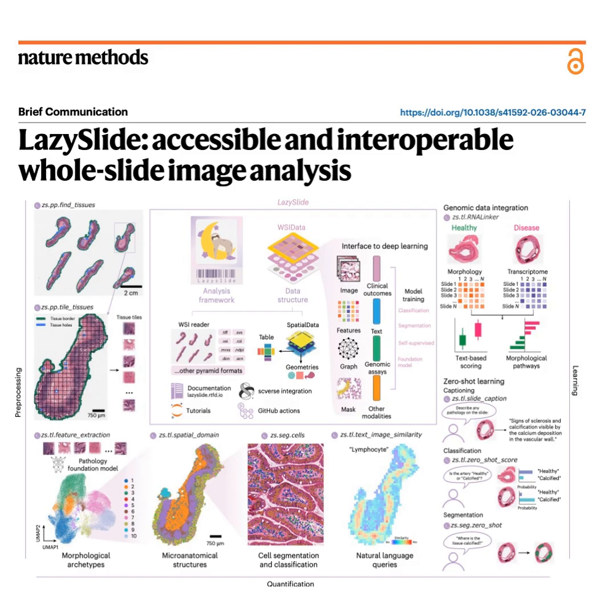Right. These models don't need to be trained on a specific task beforehand. They've already been trained on millions of image-text pairs from medical literature. They inherently understand the semantic link between images and text. So they've basically mapped the visual vectors of the tissue into the exact same mathematical space as the linguistic vectors of the English language. Exactly.